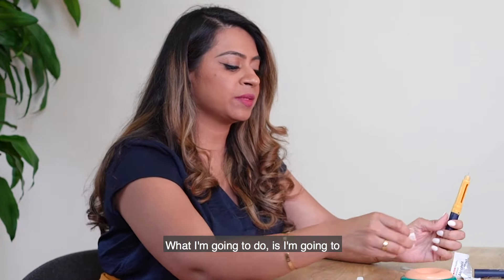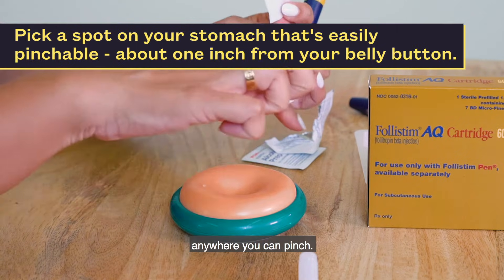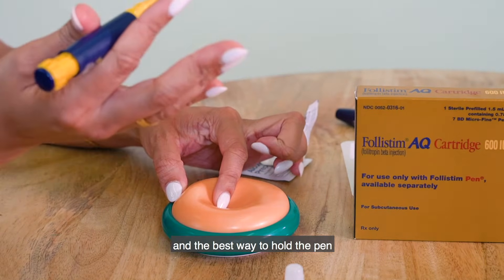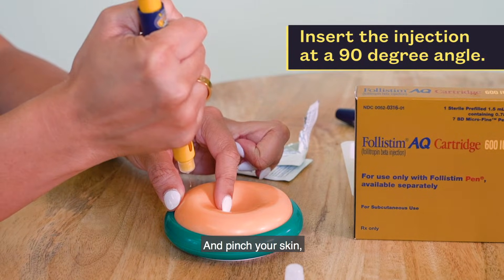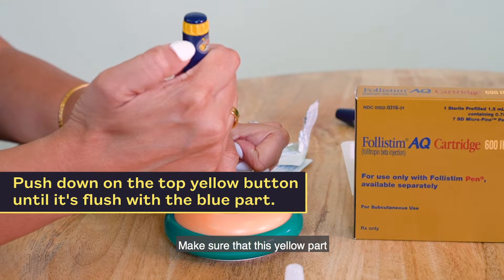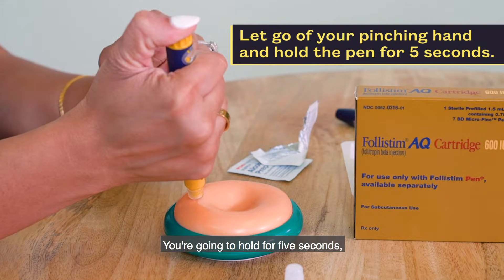Select a spot on your abdomen — look for your belly button and go one inch or more away from it, anywhere you can pinch. Clean the area off with alcohol. The best way to hold the pen is to wrap your fingers around it for good control. Pinch your skin and go in at a 90-degree angle to give yourself the injection. Use your thumb to eject the medicine, making sure the yellow part is completely flush to the blue — that's how you know the medicine has been injected. Let go of your hand, hold for five seconds, then remove the needle.